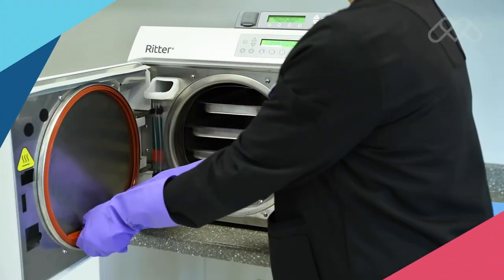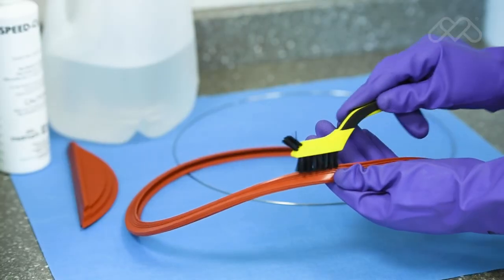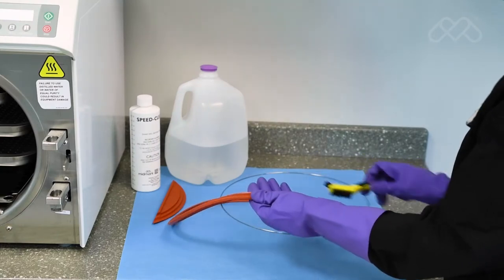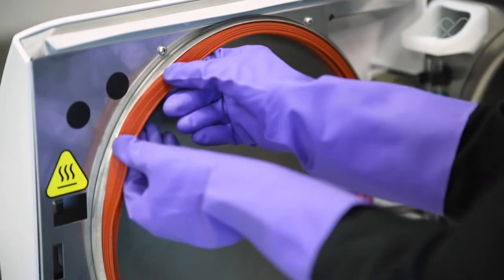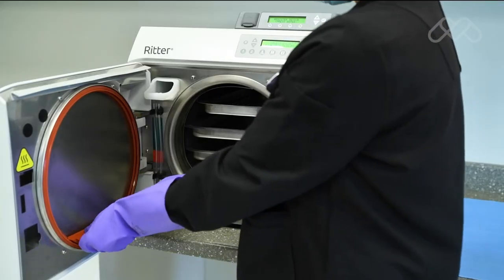Remove the door dam gasket and then the gasket ring from the unit. Clean the gasket and ring with SpeedClean, distilled water, and a soft brush. Inspect the gaskets for damage, shrinking, or swelling, and replace the gasket if damage is apparent. Press the door gasket ring into the channel in the door gasket and place the door gasket back into the door.